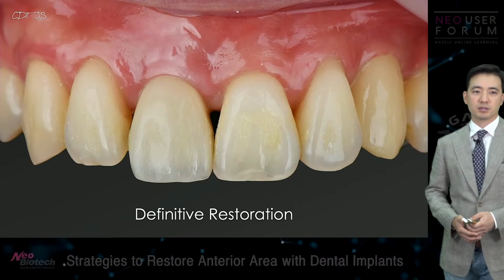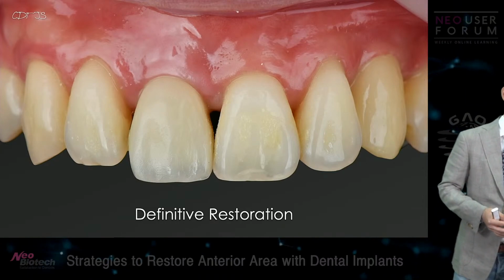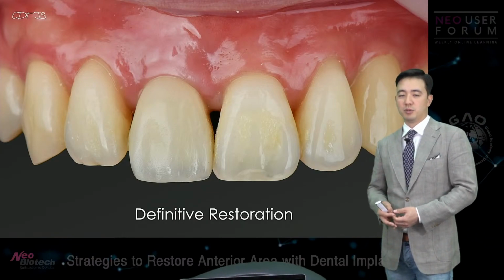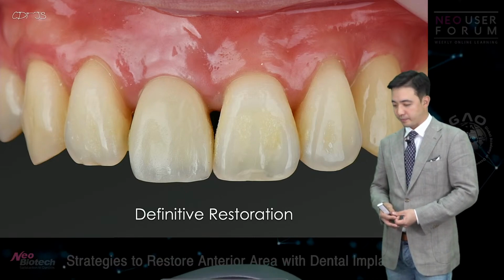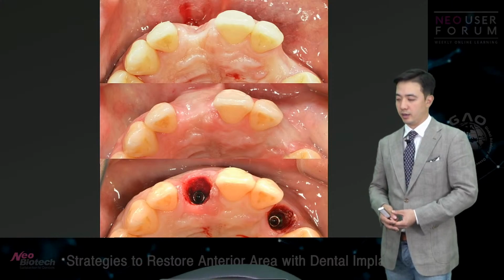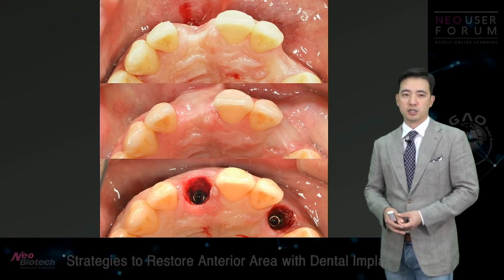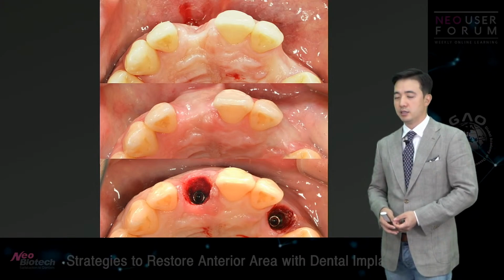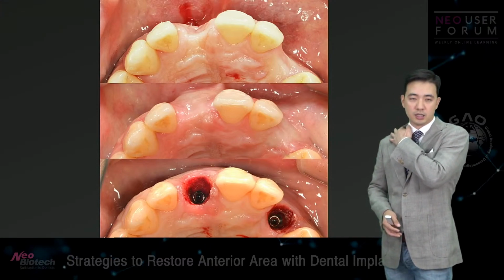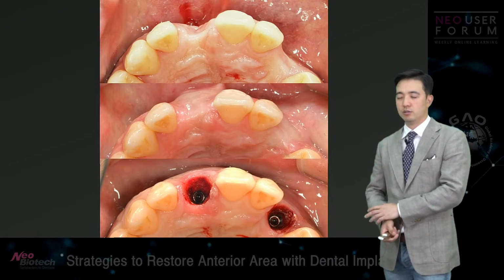Okay, so Dr. Christopher Sim asked me another question about the long-term outcome of roots left buccally. I think he was trying to ask what the long-term prognosis is when using the socket shield technique. Honestly, it's been only 3 years since I started using that technique, so I can just tell you about my own experience.